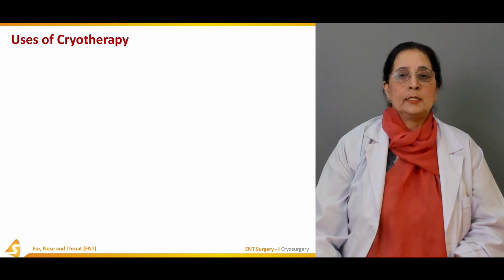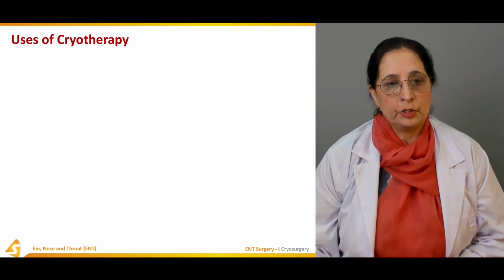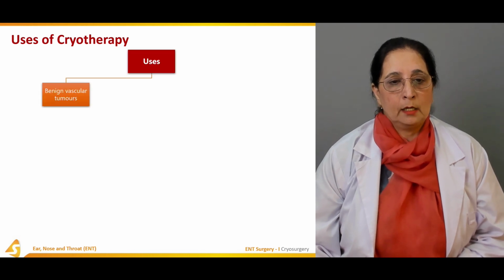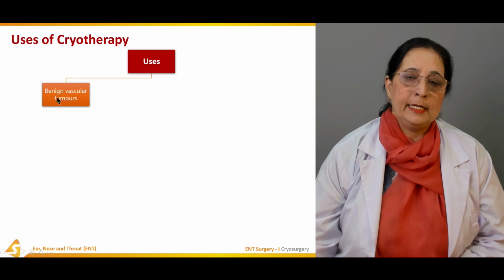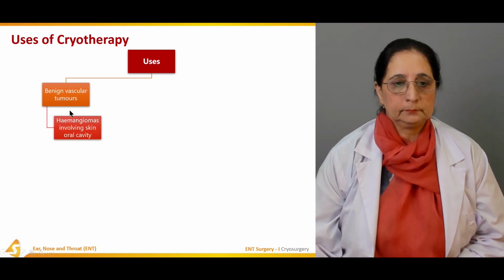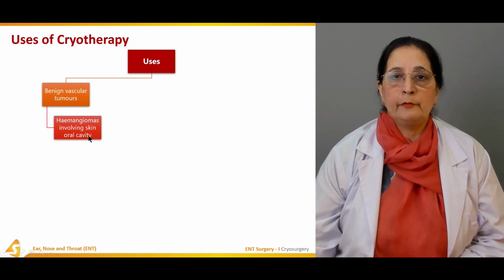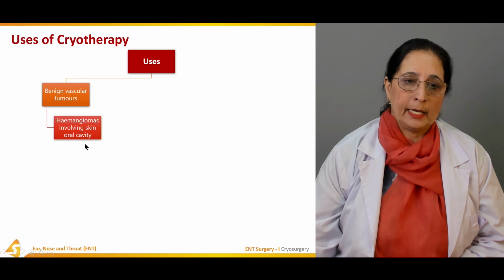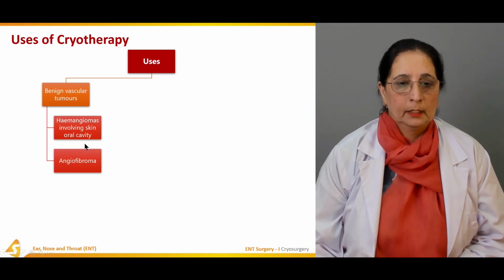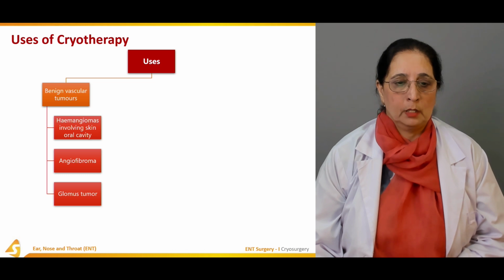Now, what are some uses of cryotherapy or cold surgery? It is used in benign vascular tumors like hemangiomas involving skin and oral cavity, angiofibromas, and glomus tumor.